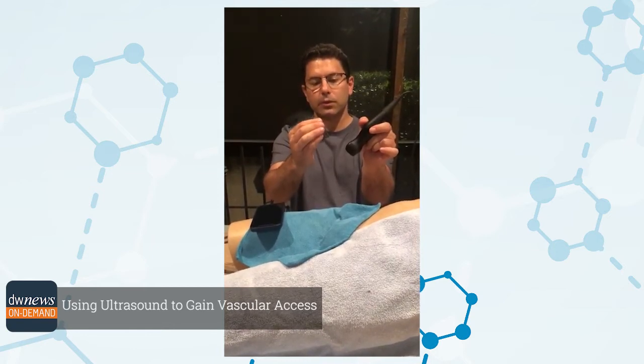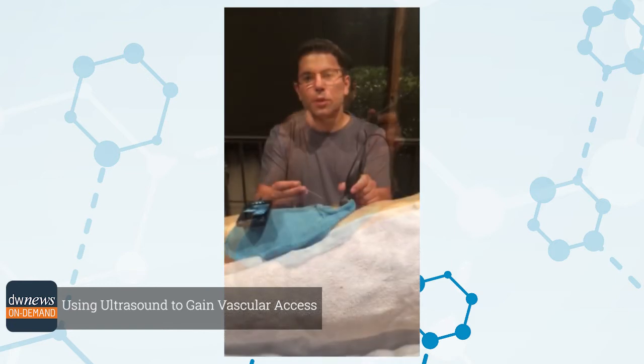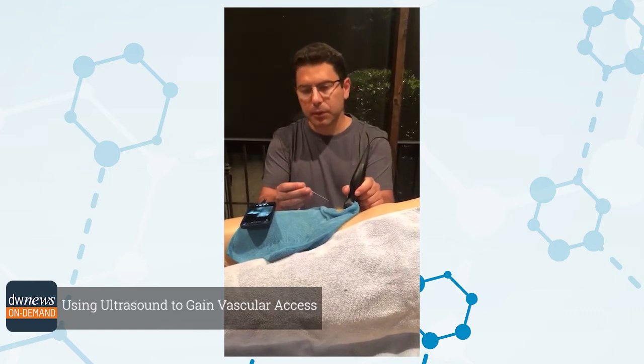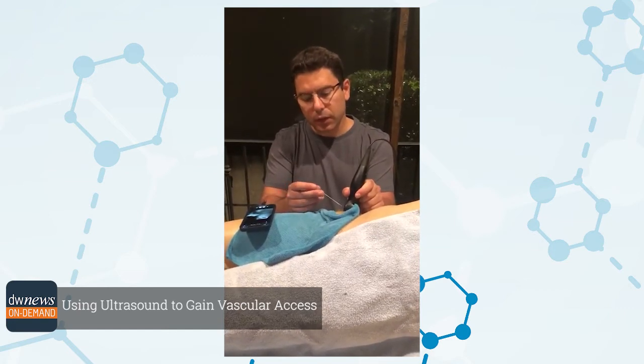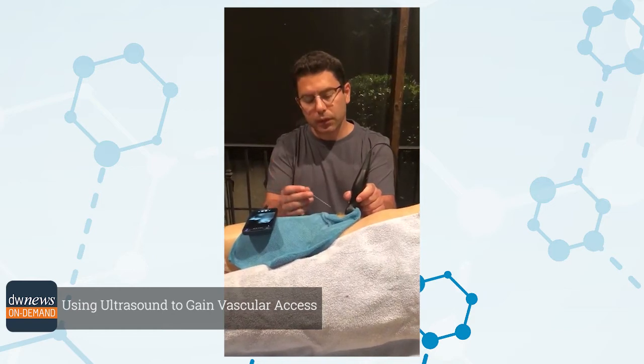The most important thing is to see the needle tip. If you don't see it, that's not ultrasound-guided access. My personal preference — obviously multiple techniques can be done — but my personal technique is I identify the target zone by fluoroscopy where the ultrasound needs to hit the artery.